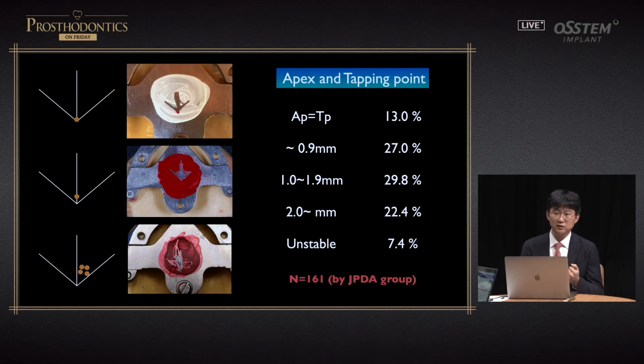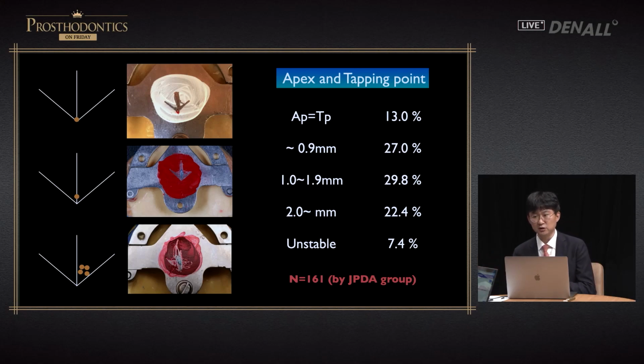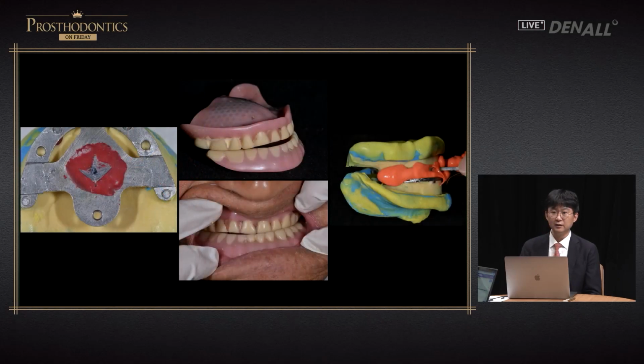In young patients, apex is the position where patients chew, but it is not the case for senior patients. Due to the relaxed ligament, the patients chew a little bit anterior to the apex. There are factors that make TMJ very unstable, including the bad habits with the existing denture and abnormal muscle adaptation. Based on my clinical experience, if the deviation is more than 2 millimeters, the position will later be changed. That occurs 10 to 20% of the cases. This is such a patient.